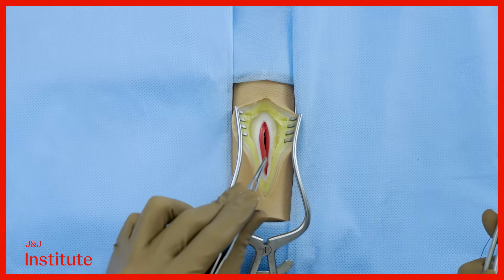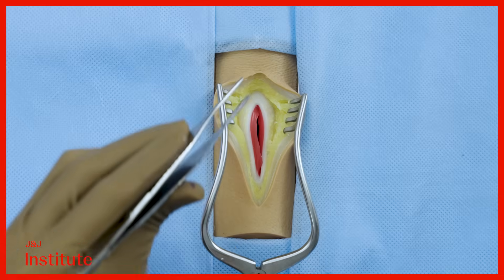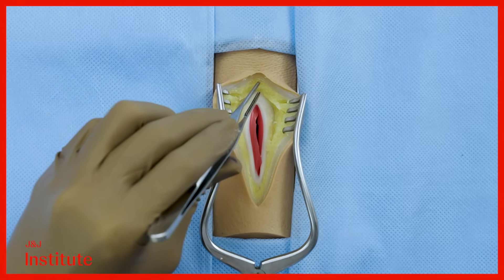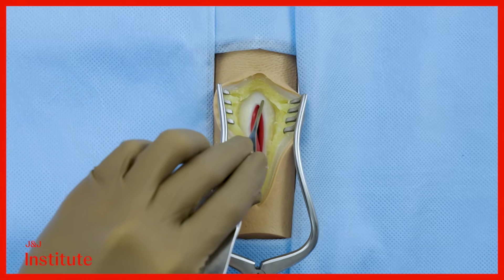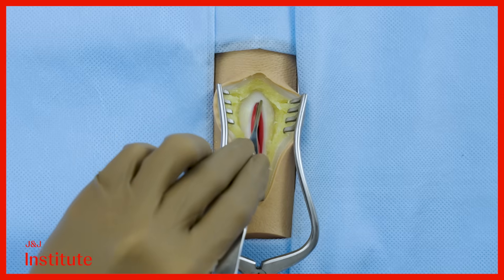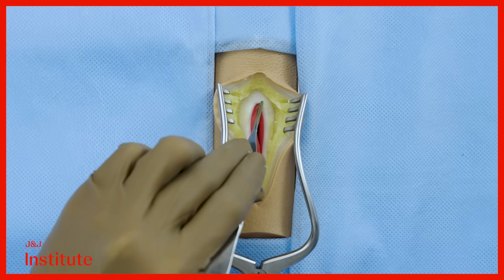With a retractor placed within the wound, it is visible that the skin incision is longer than the subcutaneous incision, which is in turn longer than the fascial incision. The corners of the subcutaneous as well as the fascial incisions are clearly visible.